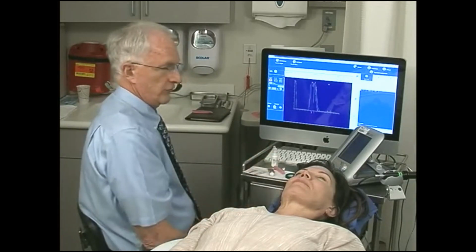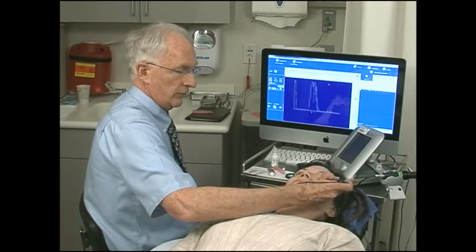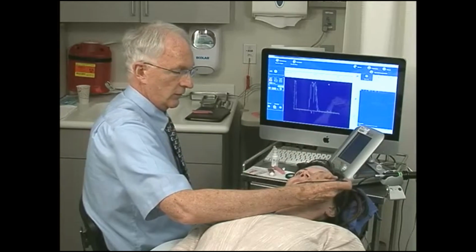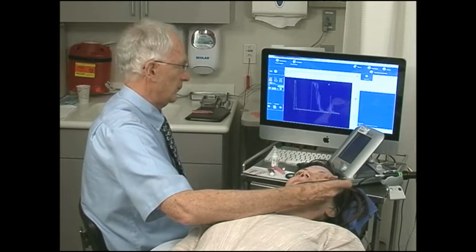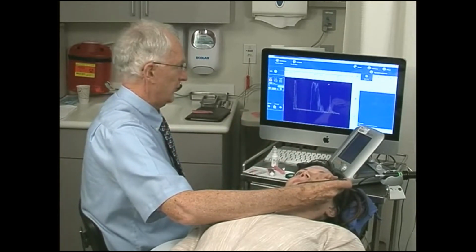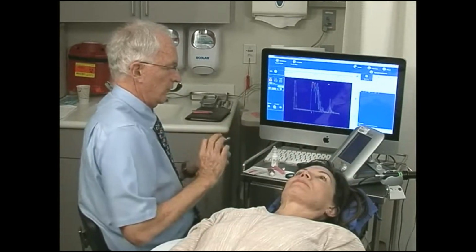I can also measure the superior oblique muscle by placing the probe inferiorly temporally on the globe and aiming towards the trochlea in this part. The superior oblique muscle tends to run along the medial wall of the orbit, so it usually is further back on the display on the screen than the other muscles. It is more towards the bone. So right here is the superior oblique muscle.